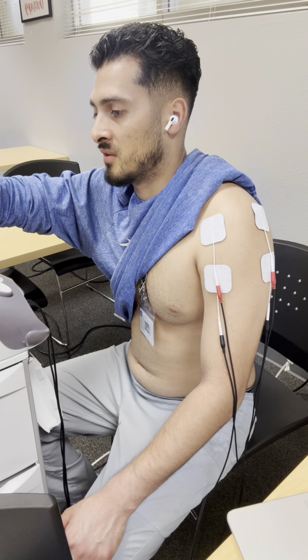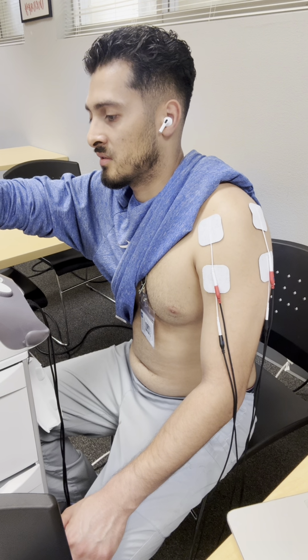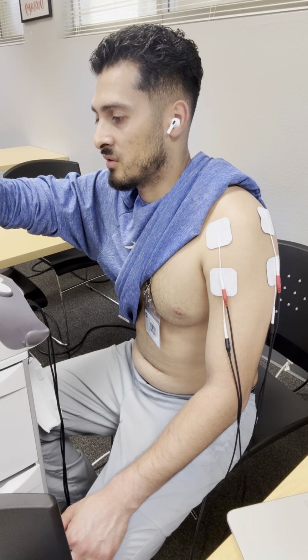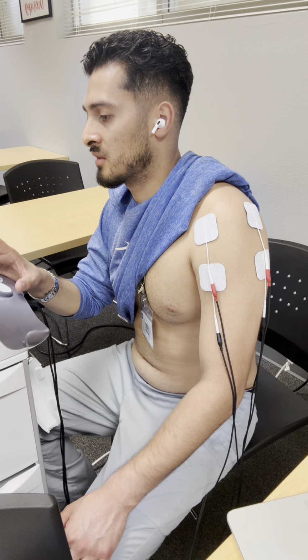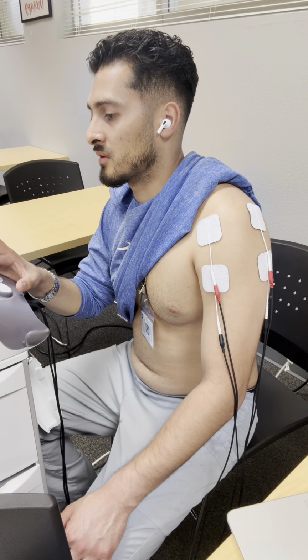Let's see, we're gonna increase it here. Yeah, so as you increase it past 45, you're gonna feel it more in one channel versus the other. That kind of takes away from it. Oh, there you go.